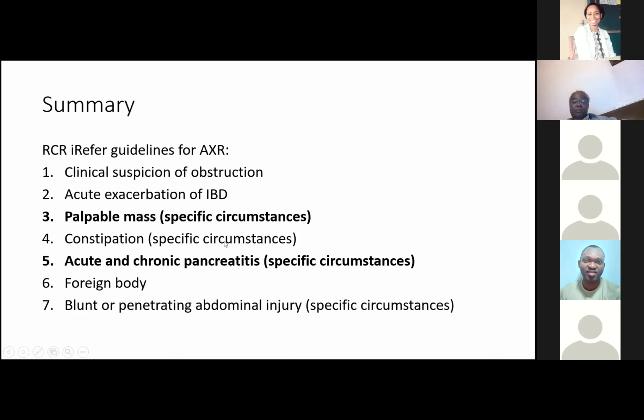Thank you very much. So the second question, please oblige my quest for shortcuts. Most of us have acronyms for how to approach interpreting chest radiographs. Most people use ABCDE or an out-to-in approach, just to get a quick summary of what exactly is happening to the patient. Is there any approach we could use to look at plain abdominal films in a systematic way, so we can take note of the most important things?